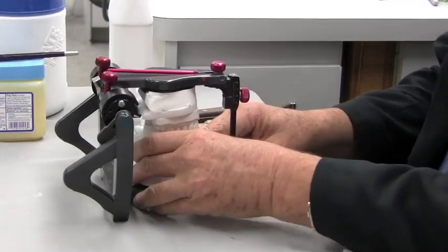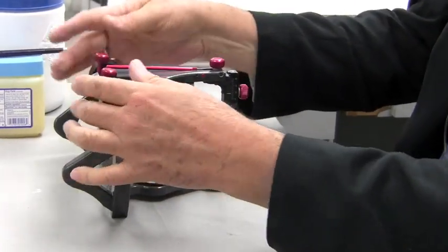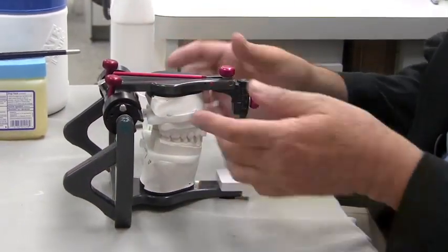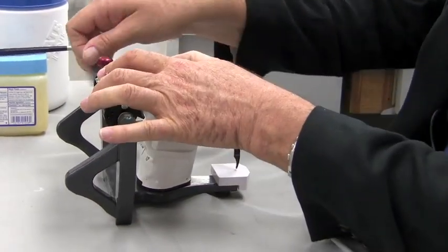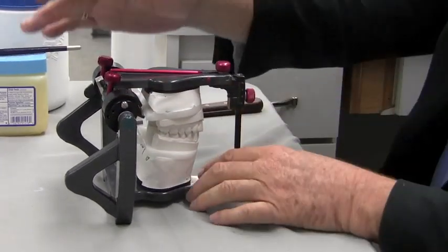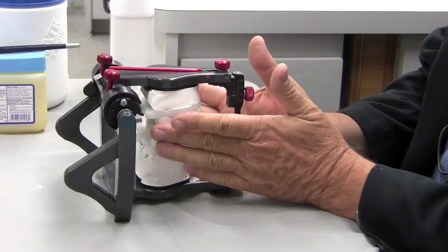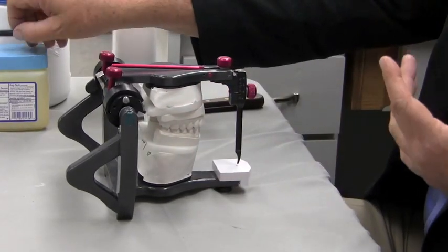That's a really nice feature to be able to convert your articulator to this kind of a configuration, at least for this purpose — but I leave them on there all the time. I prefer a closed condyle configuration. So once we've released our lock, set our condyles, lifted our pin, and checked for balancing interferences, we're ready to proceed.